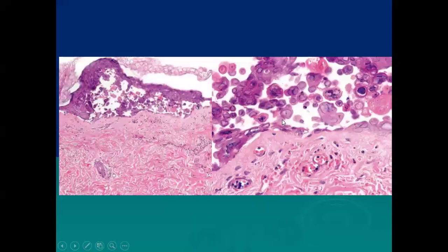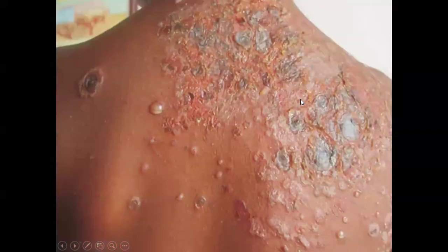And what we expect in herpes simplex is an intraepidermal vesicle or blister containing acantholytic cells. These are the acantholytic cells, as well as the epithelial giant cells. These giant cells are a conglomerate of different keratinocytes, comprising multiple keratinocyte nuclei. So this is an epithelial giant cell. It's not a macrophage giant cell. Usually the dermis is unaffected, and there is not much of an inflammatory infiltrate here.